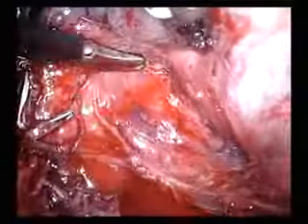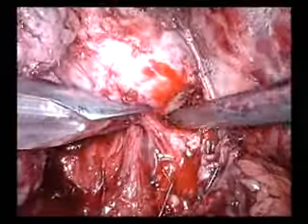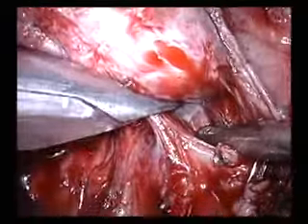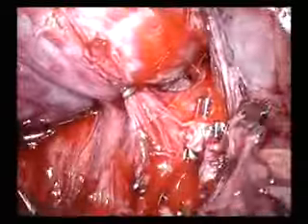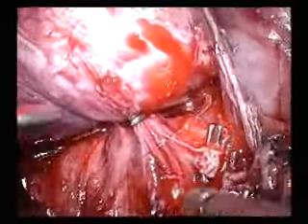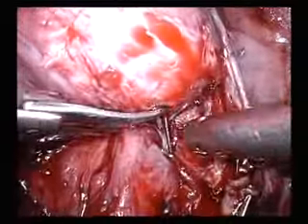When the dissection of the left side is completed, the same process is repeated on the right side. The surgeon uses the scissors with his right hand and the grasper with his left hand. The dissection is completed on both sides to free the entire posterior and posterolateral surface of the prostate.